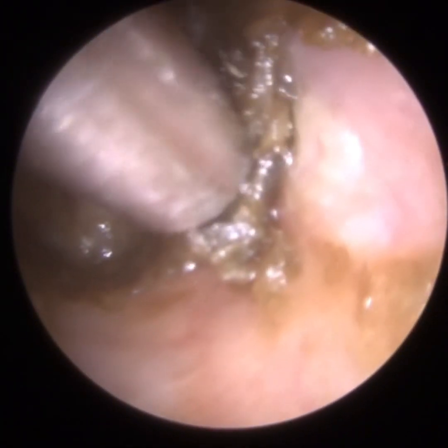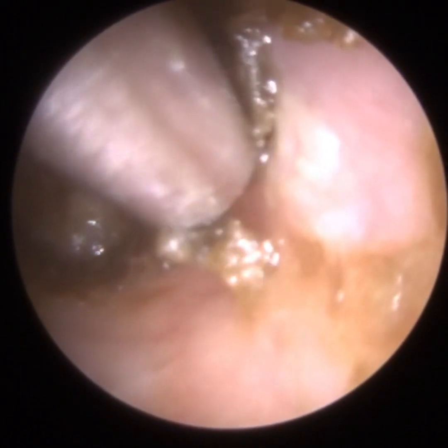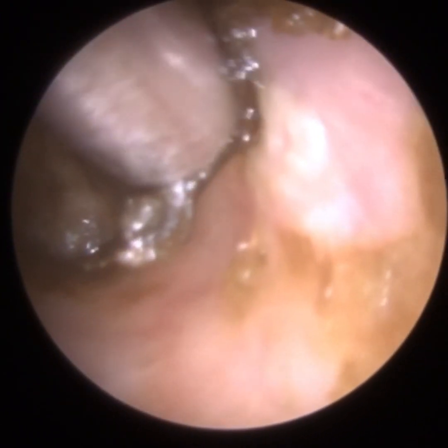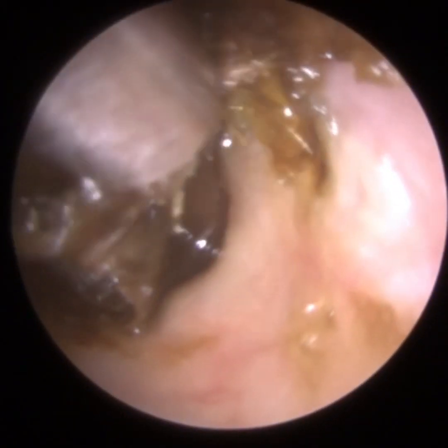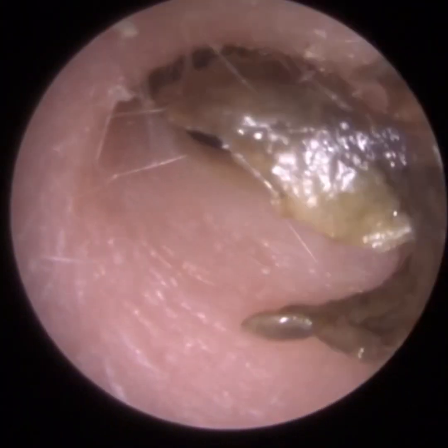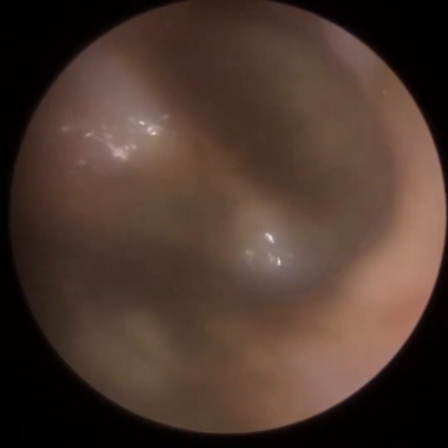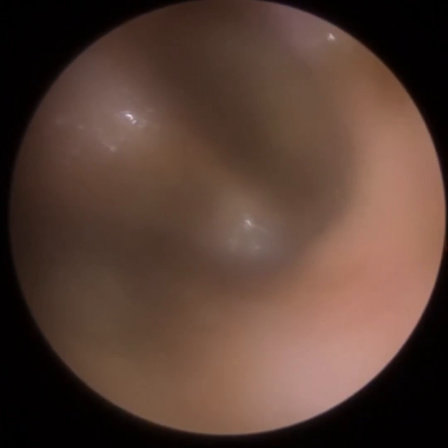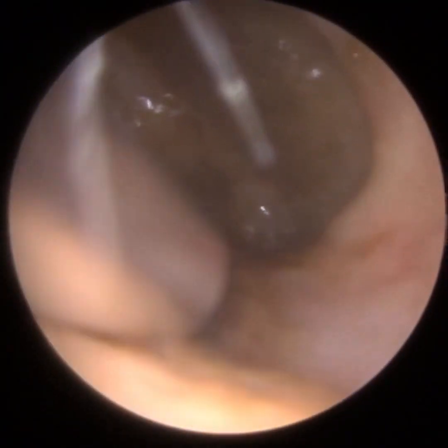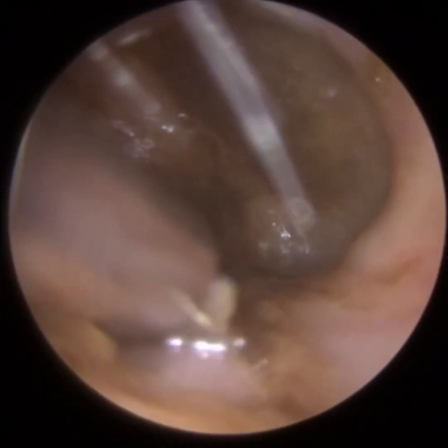This patient has got a very narrow ear canal entrance and the cartilage is quite thick, so we've had to stretch the ear open. We do that by pulling the patient's pinna back and up. The pinna is the external cartilage — the satellite dish of your ear. I elevate that back and up to straighten and widen the ear canal. I then insert the endoscope, which acts almost like a doorstop, opening up the ear so I can insert my fine-ended probe — previously I was using a full Zonar suction probe.